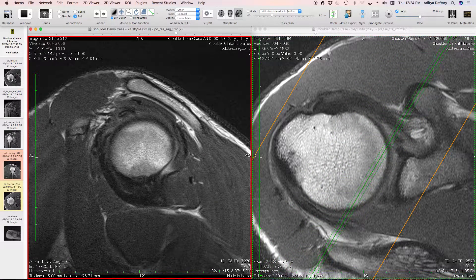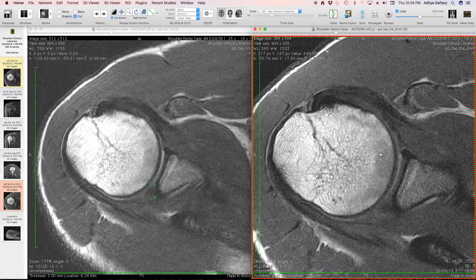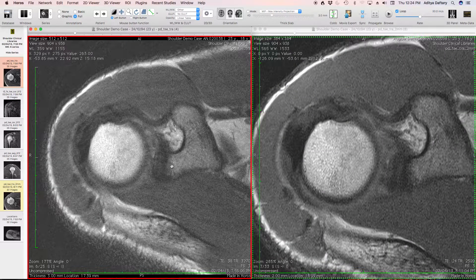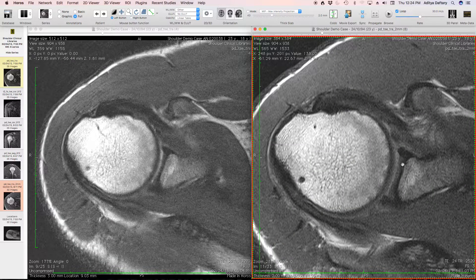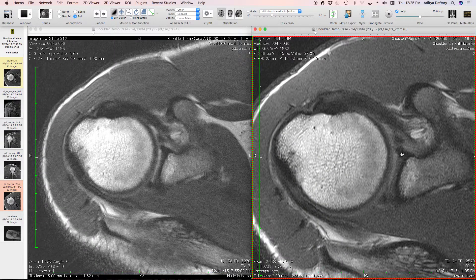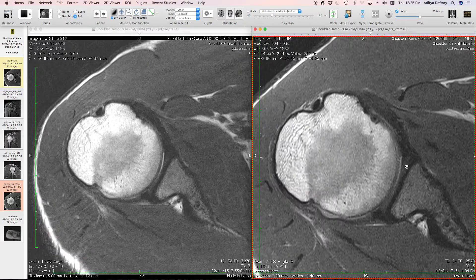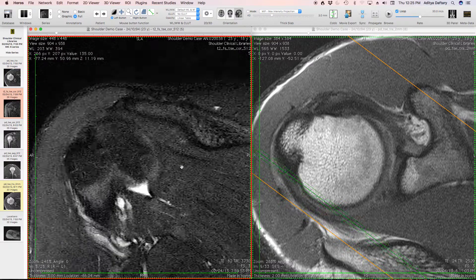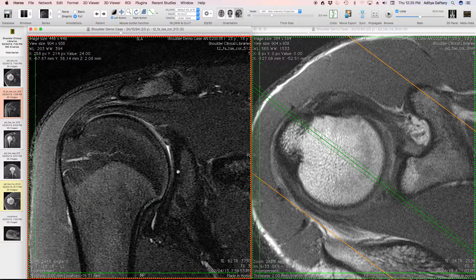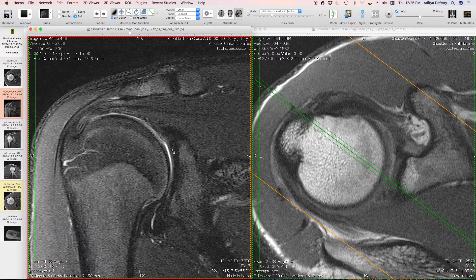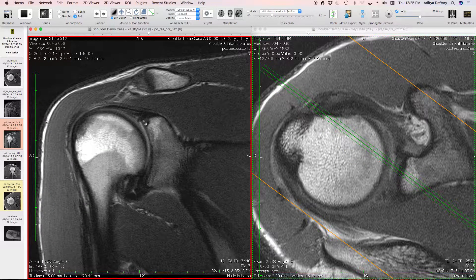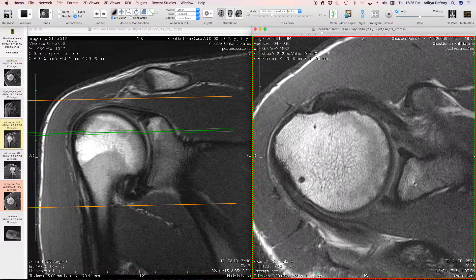Moving from the biceps to the labrum: we assess the labrum on proton density images, which are slightly more T1-weighted. Here you can see regular proton density and the more T1-weighted proton density image. The anterior labrum looks quite good; the dark structure anteriorly is the middle glenohumeral ligament. Coming down, the anterior labrum continues to look good. For the superior labrum, coronal images are best — there is no major signal abnormality within the superior labrum, other than the biceps-labral junction split already noted.